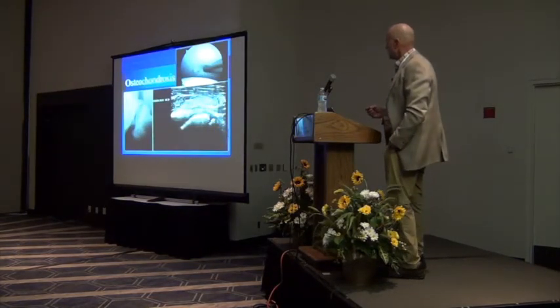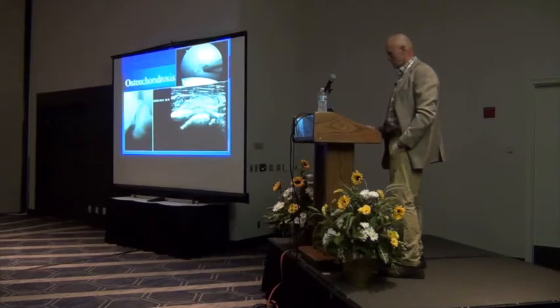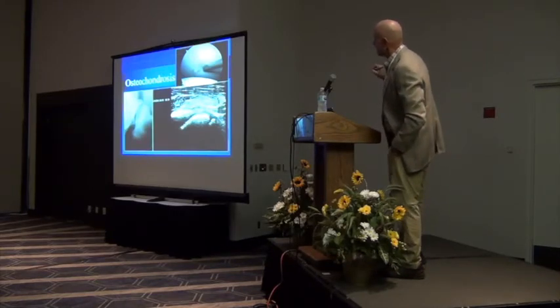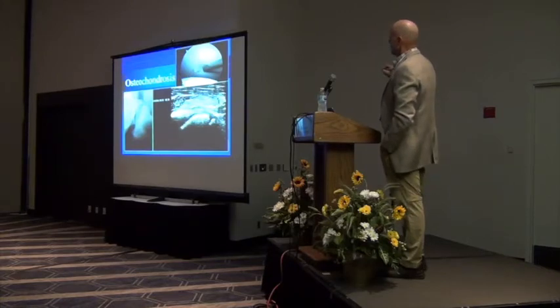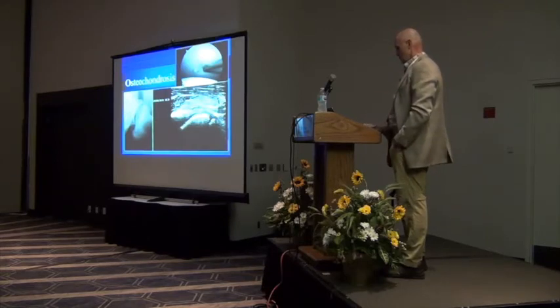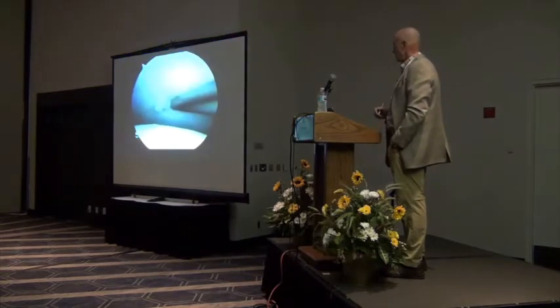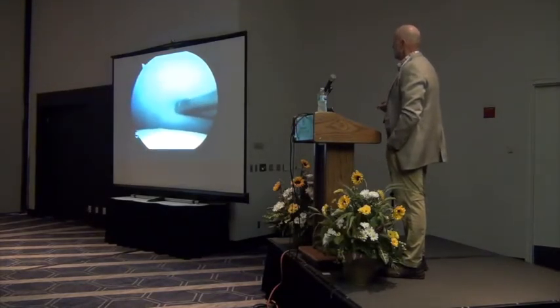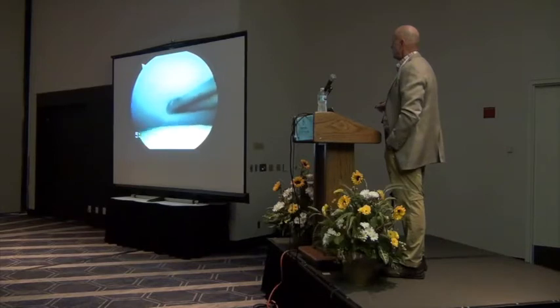And this was that same horse, and this is why sometimes it's a little bit aggravating. And I've kind of turned this radiograph up so that you can see glenoid, humeral head, and how it would represent with an ultrasound. And this is the horse when we finally stuck the scope in there. This is the glenoid cavity, and he's got a large cyst that once you pop into there, you'll see that there's a lot of fluid come out.